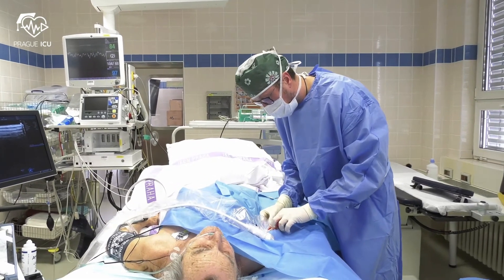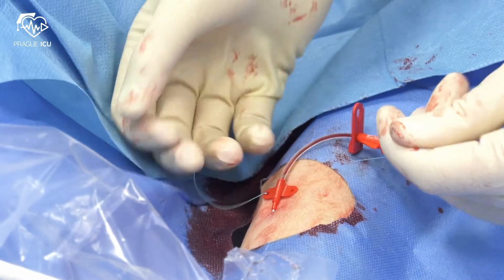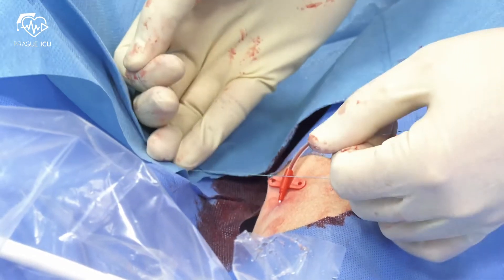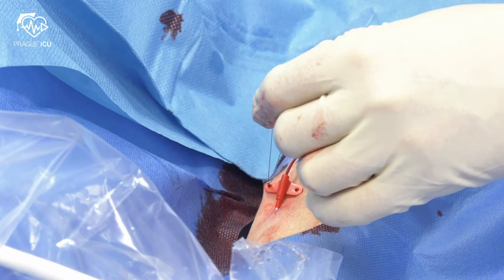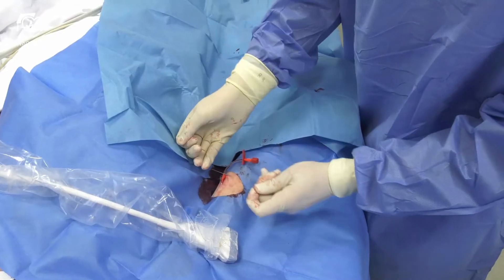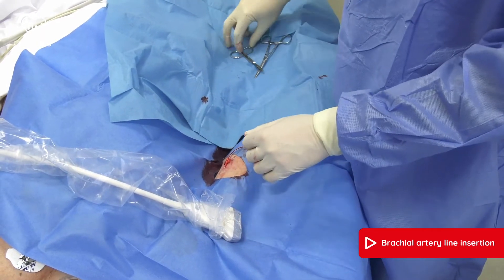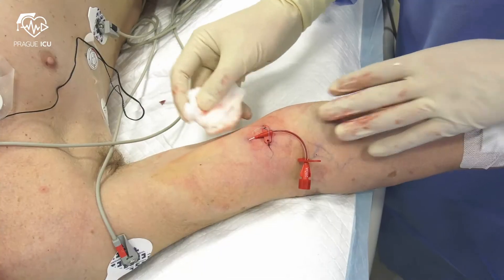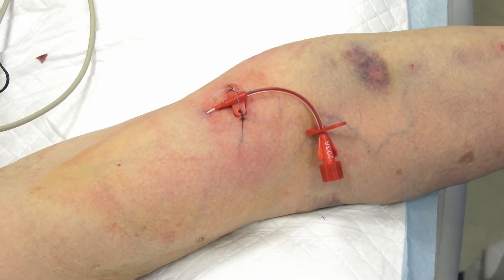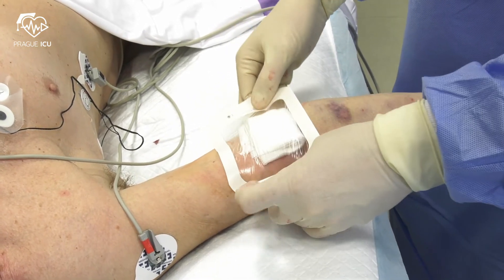Finally, suture the line. Apply the sterile dressing once the entry site of the line is not leaking or bleeding.